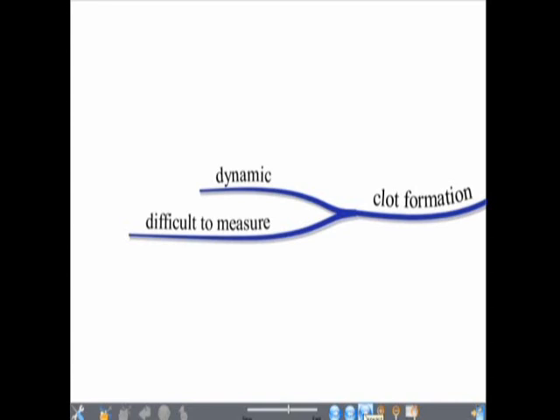that just happens. Because what normally happens is we take a sample of blood, we send it to the laboratory, they put it into a machine that spins it around in a centrifuge, separating all the blood components, and then they do some kind of test in a static environment, and then we get the results from the lab.